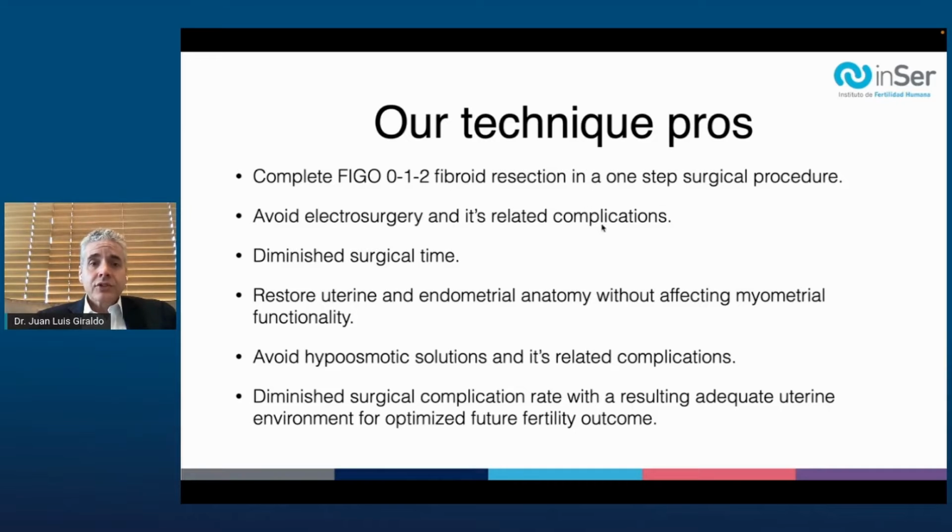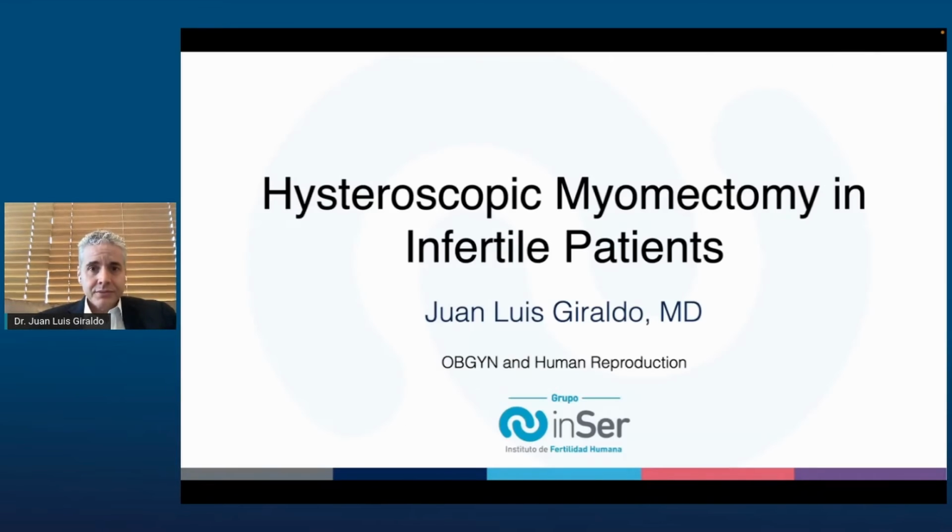2, we avoid electrosurgery and its related complications. 3, we have a diminished surgical time compared to other techniques like conventional resection. 4, we restore uterine and endometrial anatomy without affecting myometrial functionality. 5, we avoid hyposmotic solutions and their related complications. And finally, we have a diminished surgical complication rate with a resulting adequate uterine environment for optimized future fertility outcome.